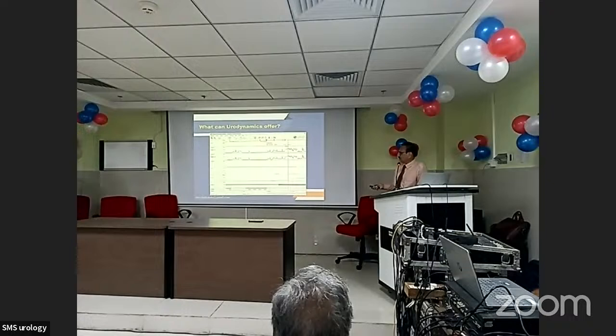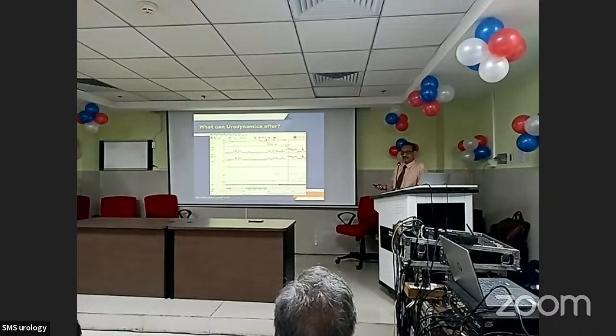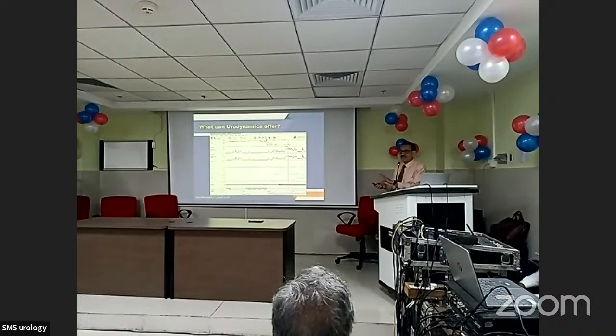Probably intrinsic sphincter deficiency. And now what happens here is when she voids, there is not much of a demonstrable pressure rise, and the flow is very low, but there is a lot of straining. Very commonly seen in elderly women. So now, in addition to all her problems, she has probably got an extensive peripheral autonomic neuropathy, which has led to the sensory loss and also led to detrusor dysfunction, and she's voiding entirely by straining.